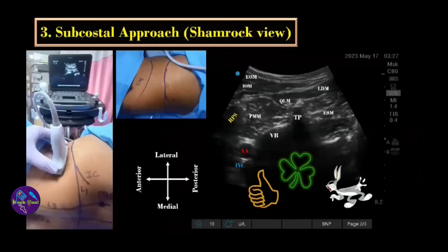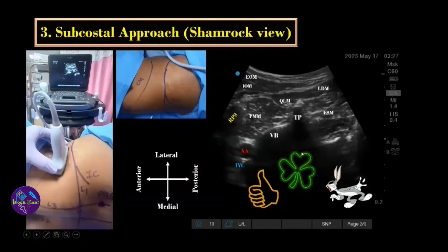The third approach is the subcostal approach, popularly known as the shamrock approach. We keep the ultrasound probe between the costal margin and the iliac crest area, just behind the mid-axillary line. You will get an image where the psoas major muscle, quadratus lumborum, and erector spinae muscle form the three leaves of the shamrock and the transverse process forms the stalk. You can also remember it as the thumbs-up sign — thumb for transverse process, knuckles for vertebral body — or the bunny head sign, where the ears are the transverse processes, the head is the vertebral body, and the nose is the aorta or IVC.